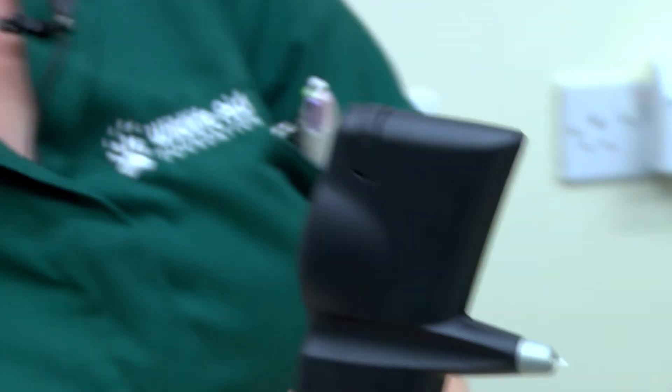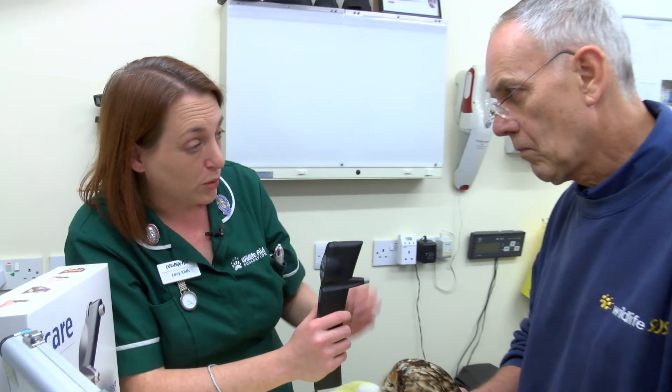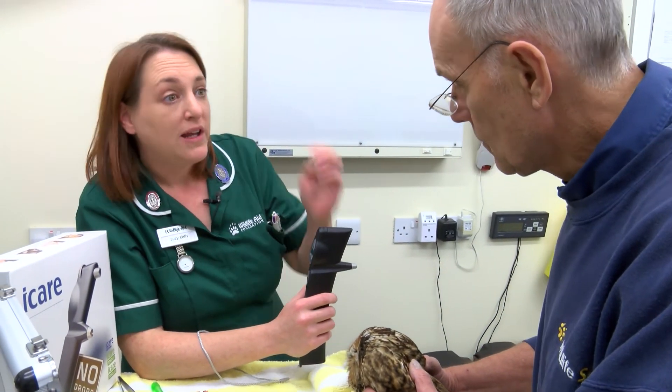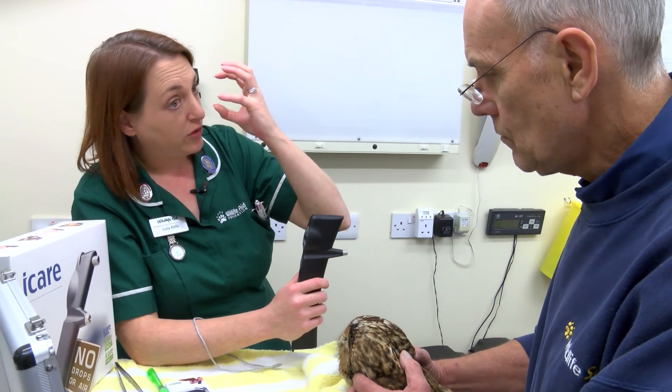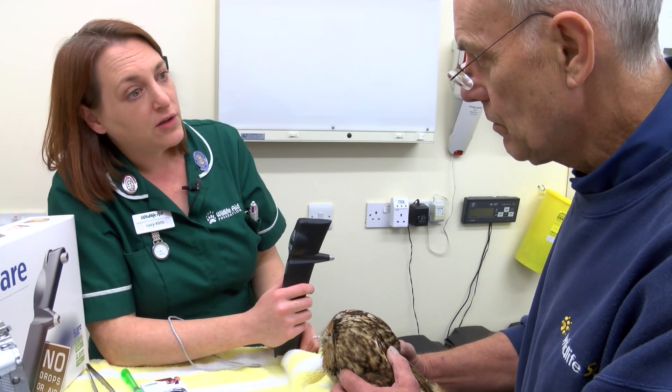That's good, and what that's told us is that that eye has no high pressure in it — it's almost exactly the same as the other eye. So we know that he hasn't got any kind of glaucoma issues happening. He still has the blood in that eye, but at least we know that the blood isn't blocking any of the normal eye drainage and causing glaucoma pain to happen, so that's really, really good.